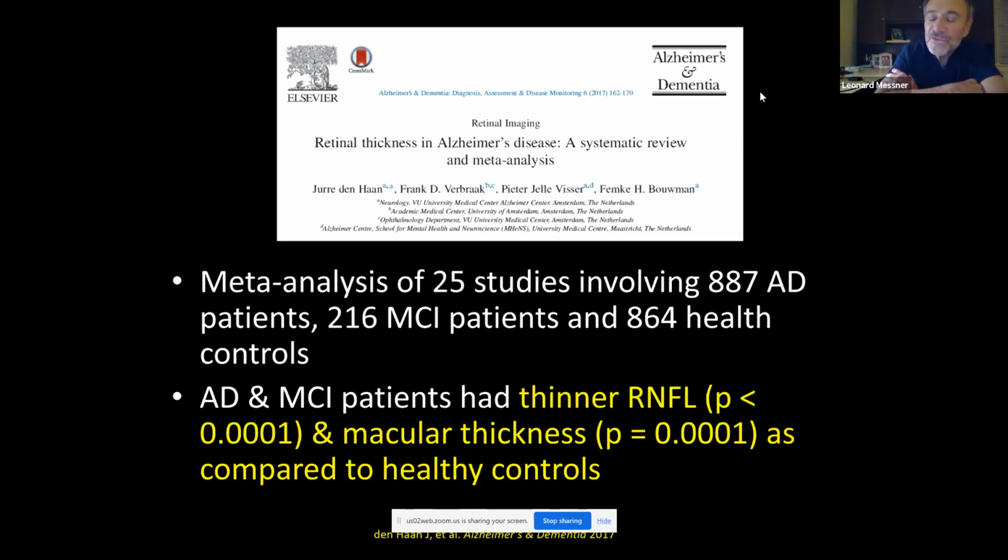And that the OCT is a simple way of being able to, at least indirectly, look at damage to these structures, but probably more importantly, is to be looking at these individuals longitudinally over time. That's where I think the real value is. Looking at a simple, cheap, effective way of gauging progression over time. And maybe that's a good place for me to end up.